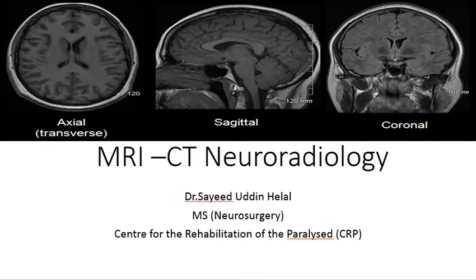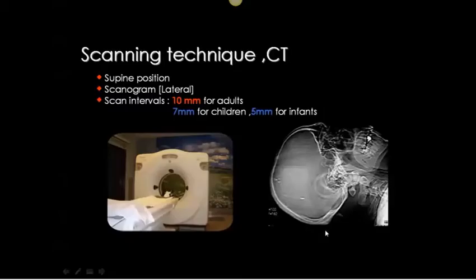Today I'm discussing MRI-CT neuroradiology, and I think I can make a series of videos on neuroradiology. Today we will discuss briefly the method of doing the MRI-CT, the scanning technique, starting with the CT.